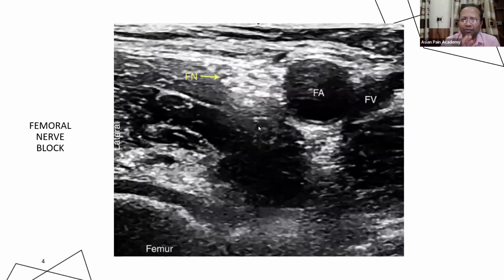Here there are multiple small nerves, which I am not describing in a basic course. We can find the genitofemoral nerve and the lateral femoral cutaneous nerve. So there are different nerves around the hip, but the main one is the femoral nerve.